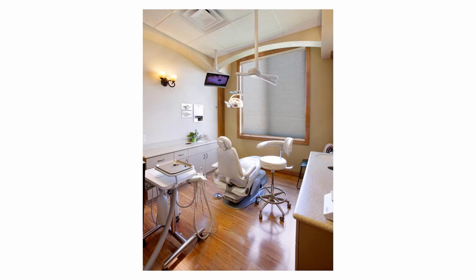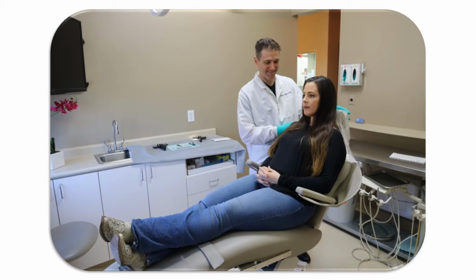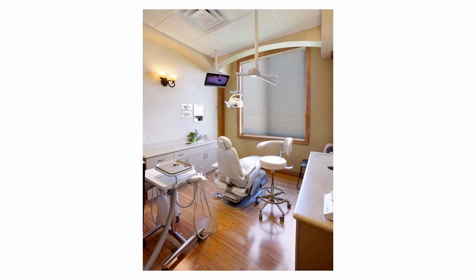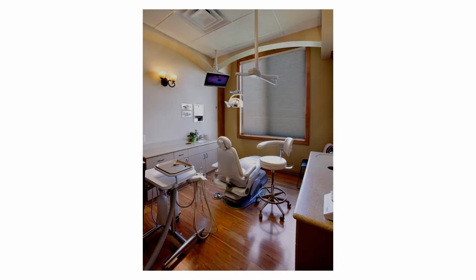If you can't do that, simply turn the patient's dental chair, and that way the big glare won't be coming from a window. There's another item, and that is your ceiling lights. Oftentimes ceiling lights are also going to be a source of glare. So here's a couple of things you can do. You can raise your dental chair as high as it'll go, and then you could be on the same plane as your patient. You don't want your patient laying down where their teeth and or shade tab are facing the lights. Now something that we can do with ShadeWave Mobile is that we can actually turn the lights off.